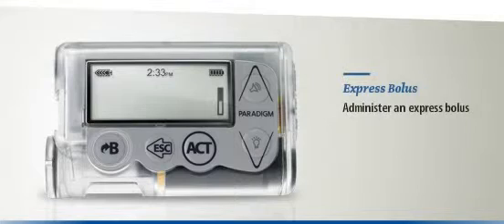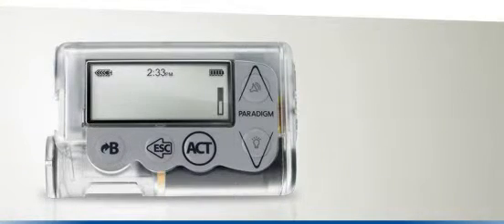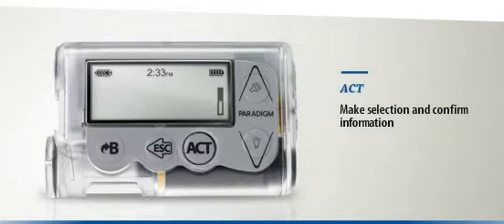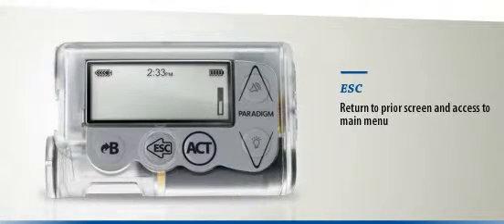Pressing the B button allows you to administer an express bolus. Pressing the ACT button allows you to make on-screen selections and confirm information. Pressing the Escape button allows you to return to the previous screen and to access the main menu.